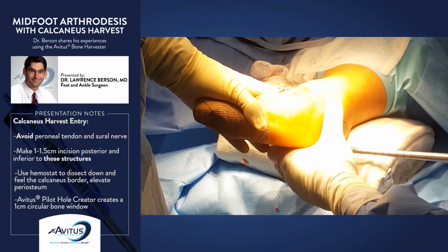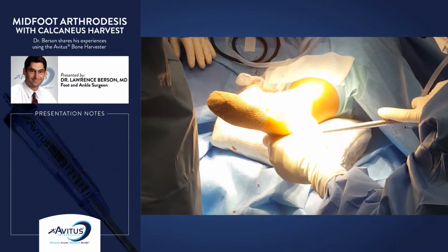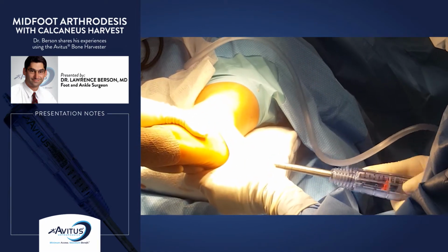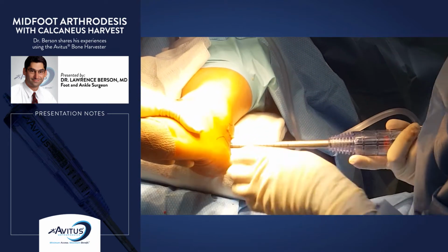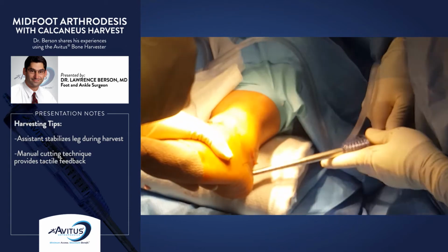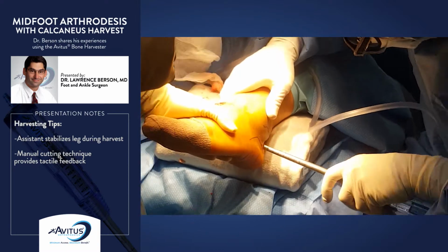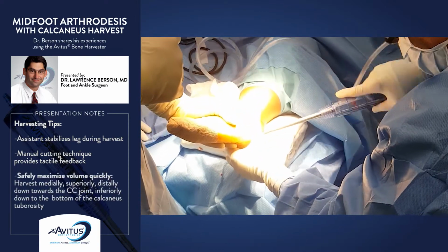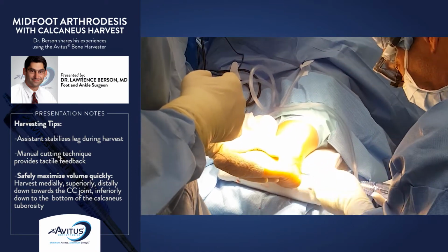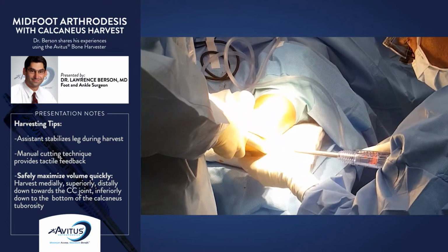I'm going to start first around my opening hole, and then I'll progress to more parts of the calcaneus anatomy. I'm having my assistant stabilize the foot while I obtain the graft. And since this is a non-powered instrument, you've got pretty good tactile sensation on where the tip of the curette is going. I think the risk of plunging through the medial cortex is minimal.